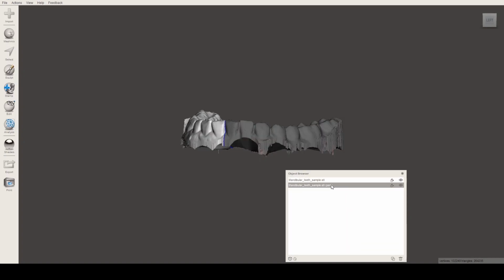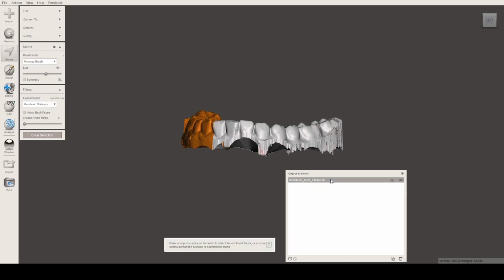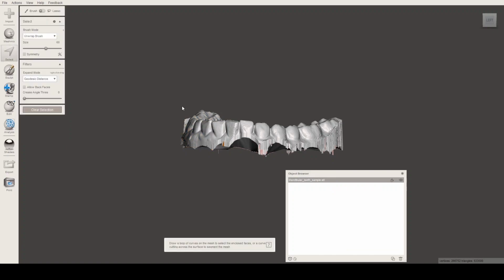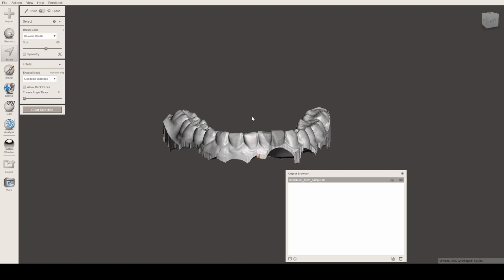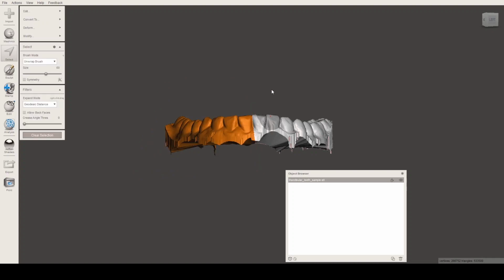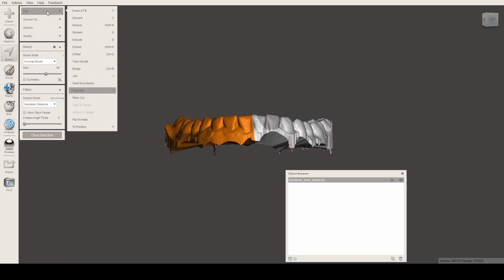So just select the part that you want to separate. For example, let's go back to the old model and make this thing whole. Actually, let me try something. This is just a curiosity of mine. I'll try to merge an object if it's possible. I think it's possible if this functions like Photoshop. As you can see, maybe it can also separate and join two objects together again.